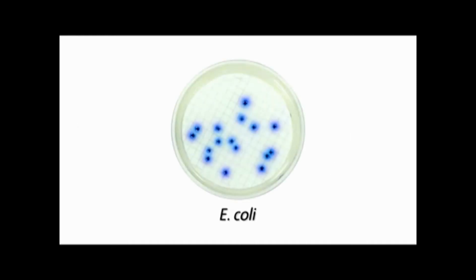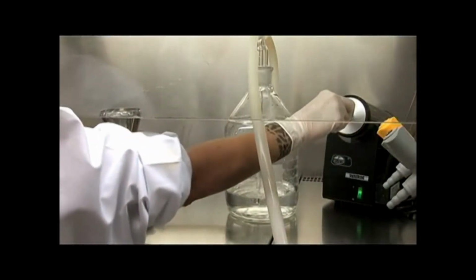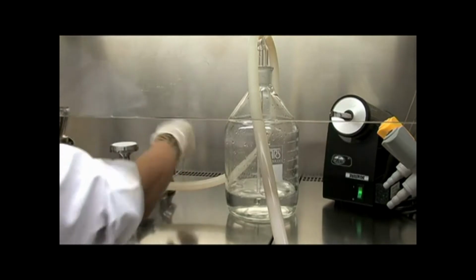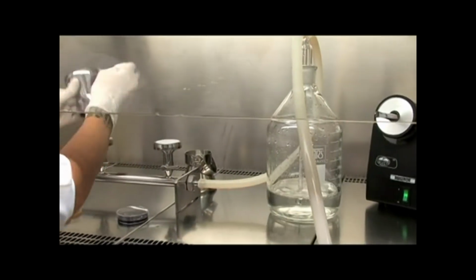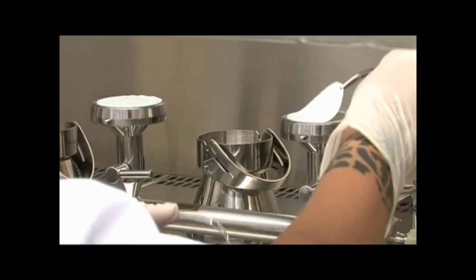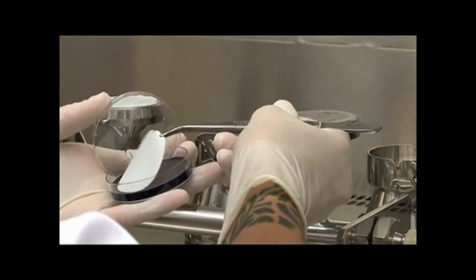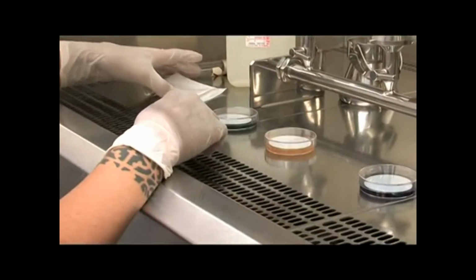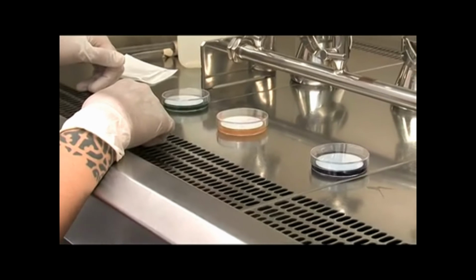Escherichia coli, E. coli, is a type of coliform, which has been selected as an indicator for the presence of coliforms, other enteric pathogens, and direct or indirect fecal contamination in water and foodstuffs. CCA is a solid, selective and differential culture medium used for the detection, enumeration and isolation of coliforms and E. coli in water samples by the membrane filtration technique, in particular in water for human consumption.